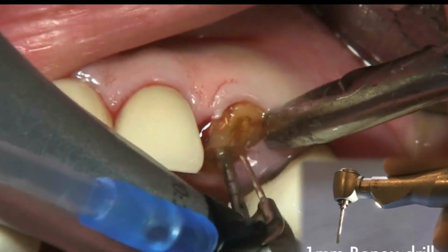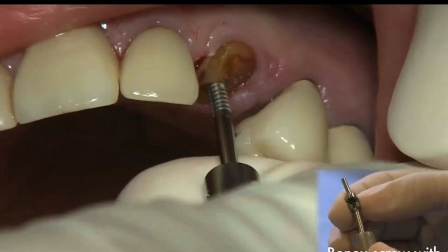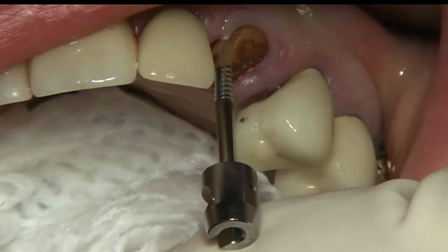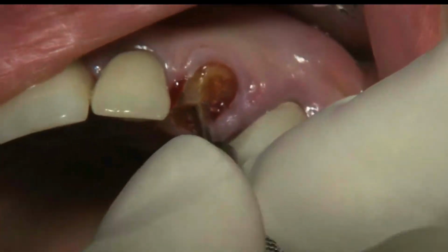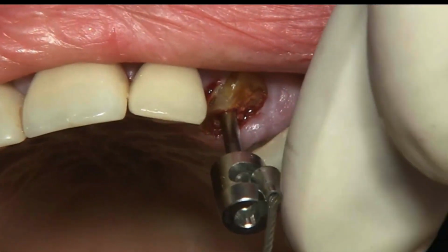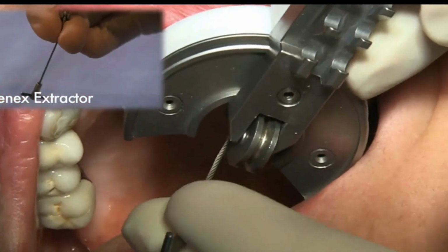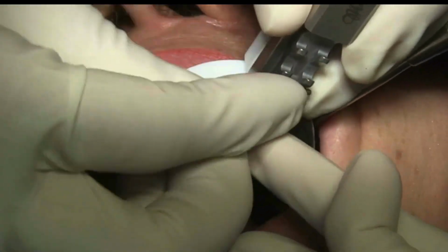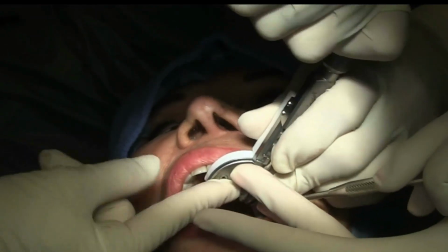And now I'm showing also the Benex extractor. You use first a 1mm drill. Then you turn it in with your hand, and then there's also a little device, a torque wrench you can use. You really want to make sure that mechanically it's stable in the root. Nice and stable right now. And there you go. I attach this, it's almost called a torture device. Here's the Benex extractor. Here's the device, which is very efficient, really German made. And then you're pulling it out and getting it into the right side.